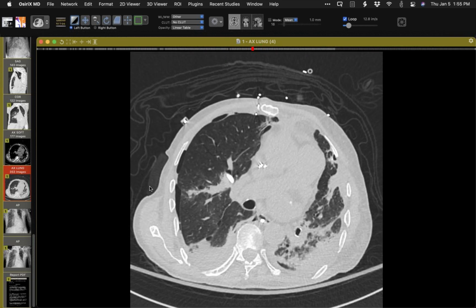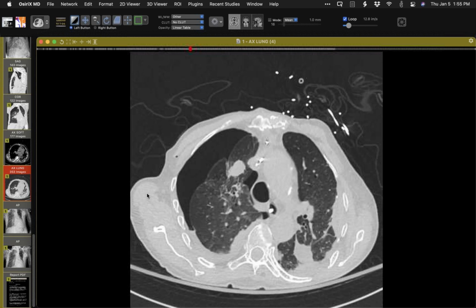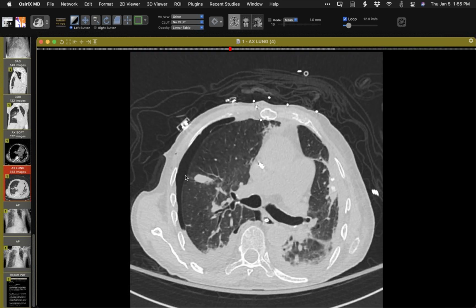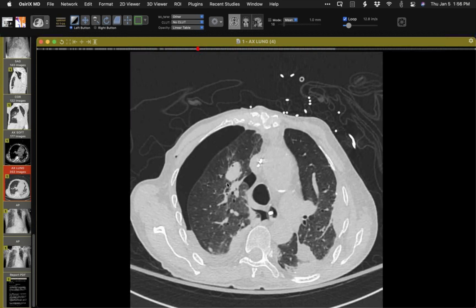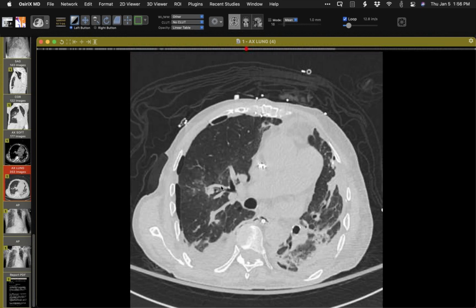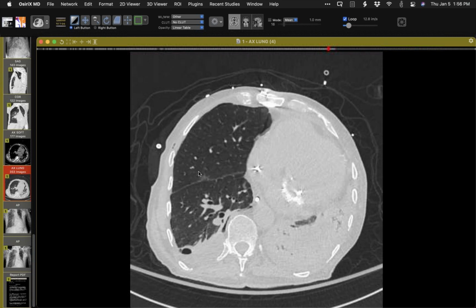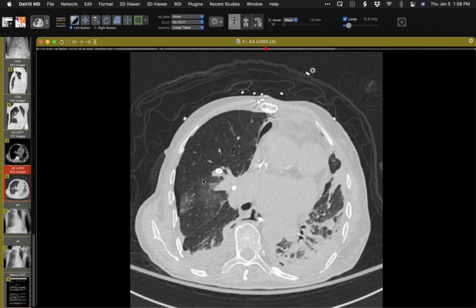So it is pulmonary. The other observation was that this opacity containing a bit of air goes all the way from there to there, and that corresponds precisely to the track of the catheter that he had previously. So this unfortunate person has had the passage of 2 pleural space catheters into lung, once in the right upper lobe and more recently in the right middle lobe. My understanding is that at surgery, at least on the left side, because he had a left chest tube previously, he had a lot of adhesions.